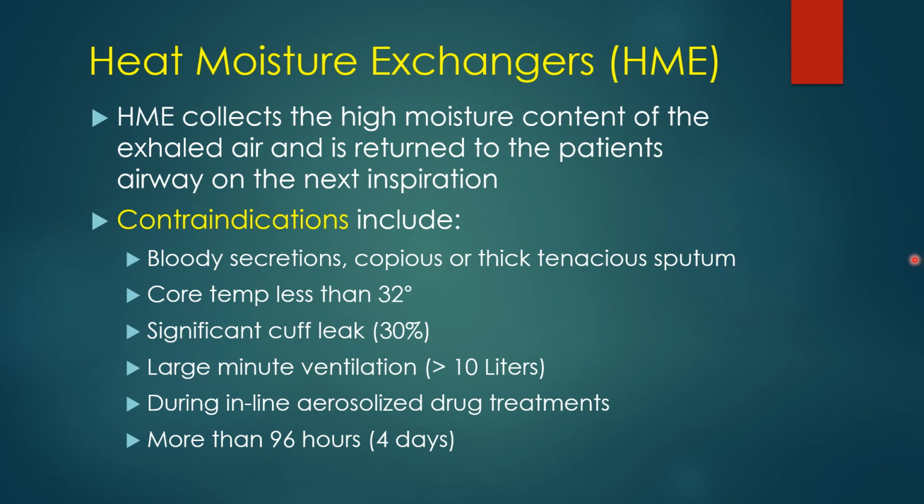Sometimes we won't have an active humidifier. We'll have a heat moisture exchanger. Those have been shown to work just fine during surgery and in patient transports. When you go from one part of the hospital to another, you don't have to carry all that water and the active humidifier on your transport ventilator. But some places, they use the HME on all of their ventilator patients. I'm sure you've all learned about HME by now. The HME collects the moisture and heat from the exhaled flow and gives it back on the inhaled flow of gas through the HME.